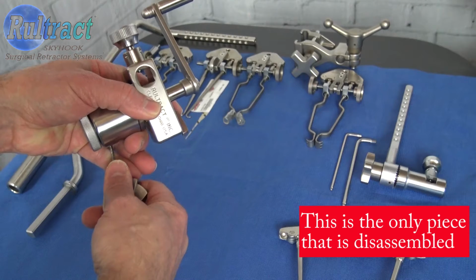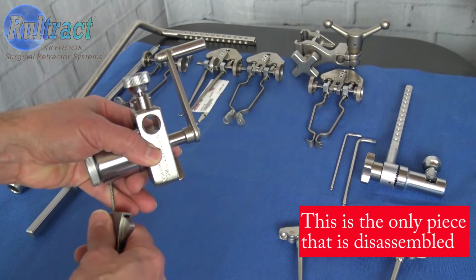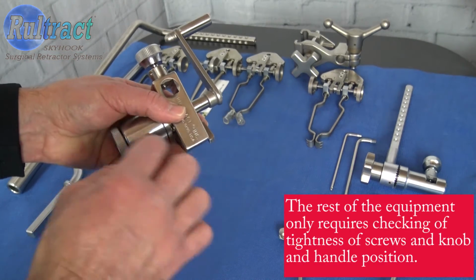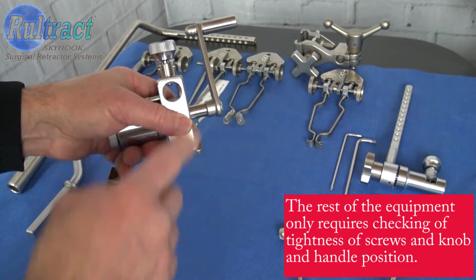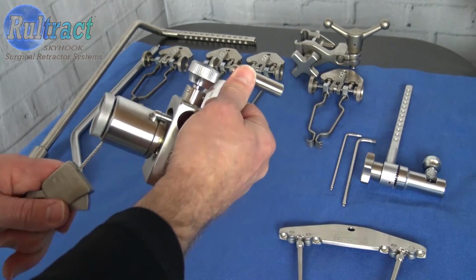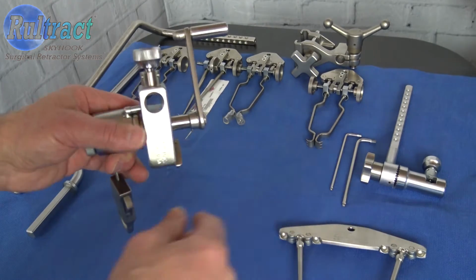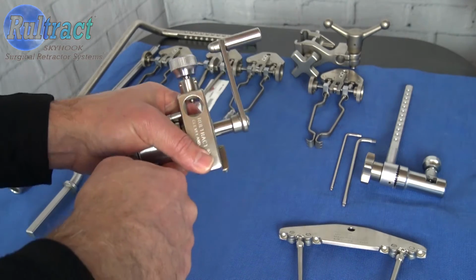Now I say pull the cable from the spool and not unwind the cable, because you don't want to use this handle to unwind the cable to remove it from the spool, because it can get kinked inside the spool. So we're going to pull the cable down out of the spool. Very important here that you hold this piece of equipment by the spool. If you put your hand over this handle, try to pull the cable out, this handle will not be able to turn or rotate, and the cable can't be removed from the spool. So go ahead and hold it just like I am here and try to pull your cable out.